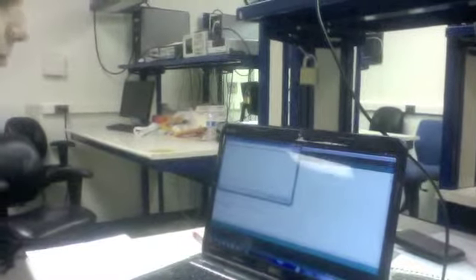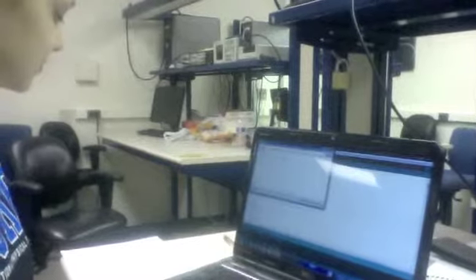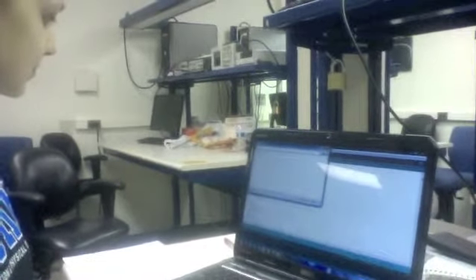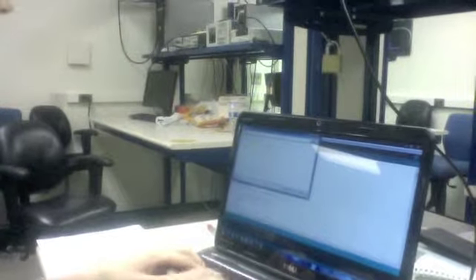Hi everyone, this is EpiCool and we're gonna do a demonstration of the functionality and user interface of our C cubed system. Alright, so the first thing we have to do is, on the interface side of the device, we need to set the parameters for the cooling that we want to do. By doing that we can enter any key and the device will start listening to us.